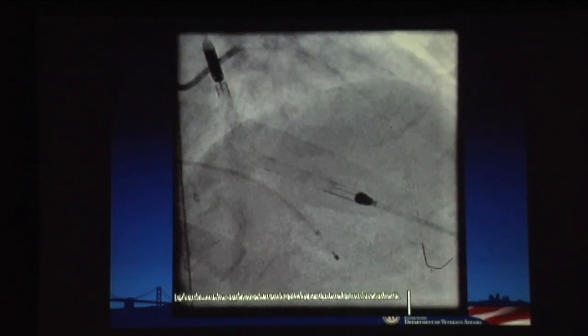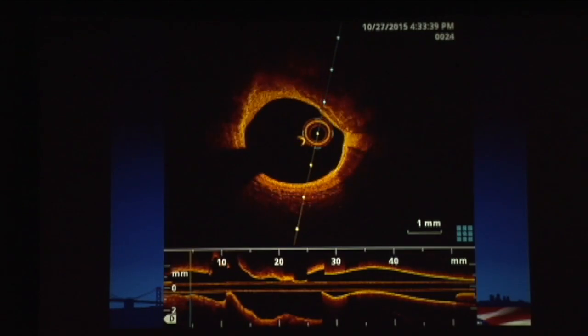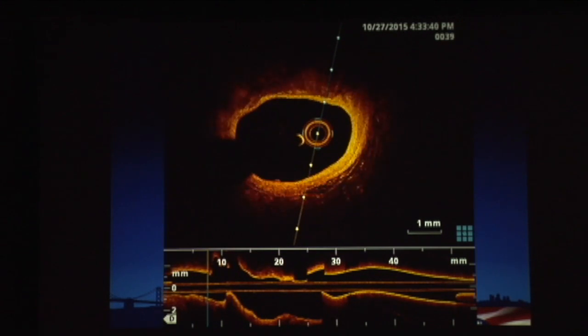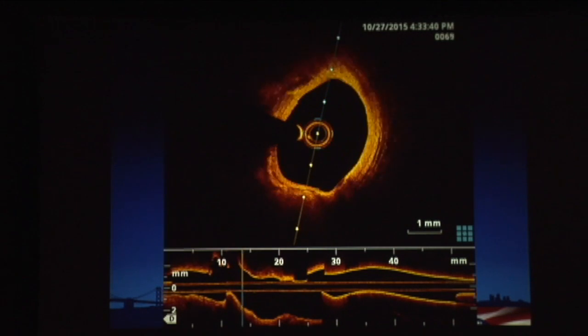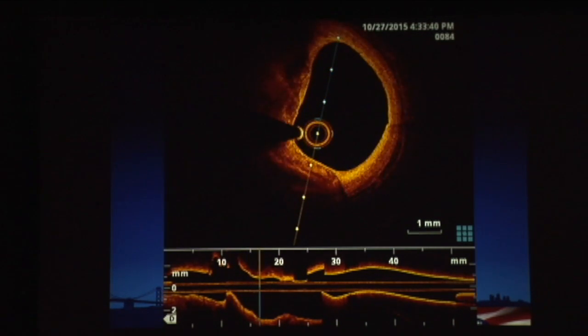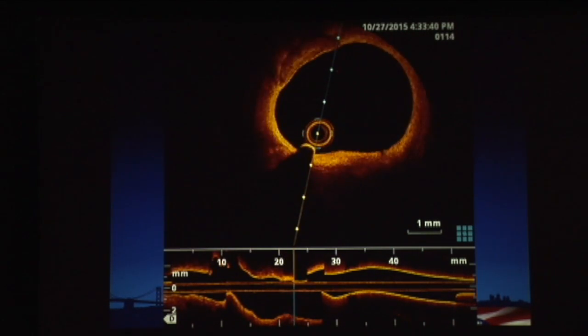And this is the first image that we took, which is basically, you see a catheter marker being pulled back. That's an OCT run. So we performed OCT to sort of settle this. How bad was the distal left main and LAD, and how would we have to manage this? This is the OCT run. You've seen these before, I'm sure. You'll notice, up at 12 o'clock, there's some calcium nodules going by. There's some lipid. I'll stop and show you the areas where we did measurements, but we just went past the left main, and then we'll be into the guide catheter.